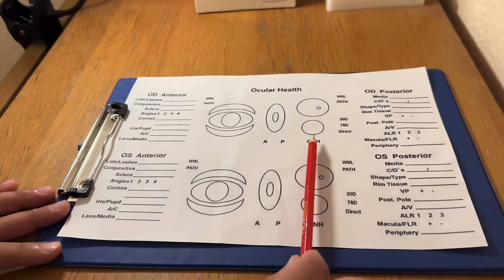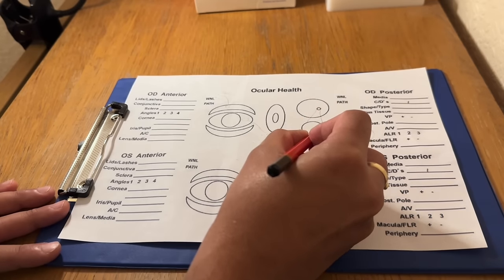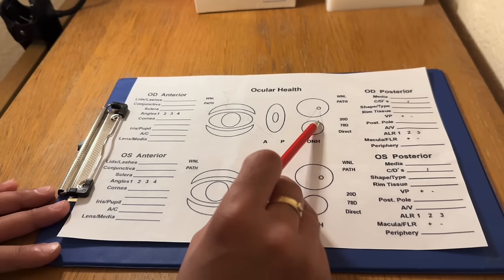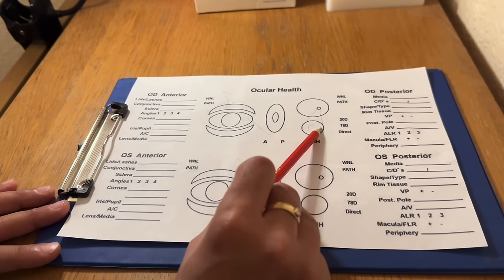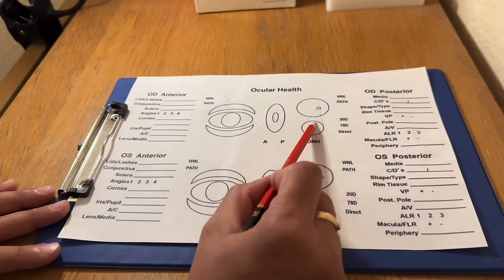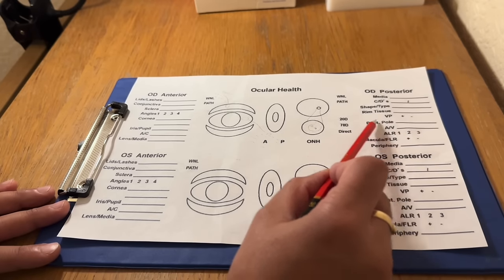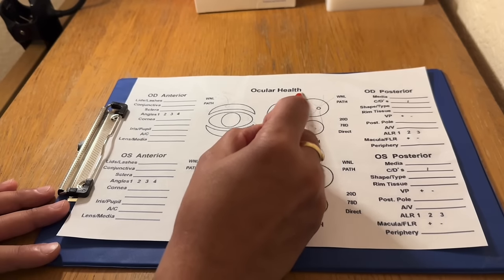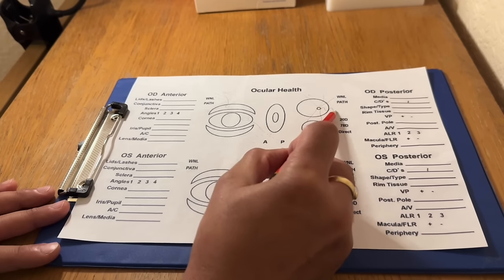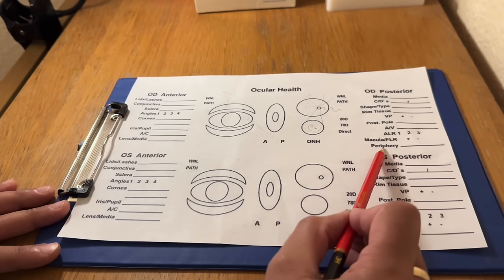Looking at the posterior side, we have a part here for the optic nerve, which is essentially just a blow-up of this part. We can look at the media — so just the vitreous — the CD ratio, shape and size of the optic nerve or the cup within. We can make a note of the CD ratio, look at the neural retinal rim tissue and describe that, the venous pulse, and the AV ratio of the blood vessels. We could draw the vessels, comment on the ratio, and also be looking for any tortuosity. Then some notes on the macular region and the peripheral retinal section.